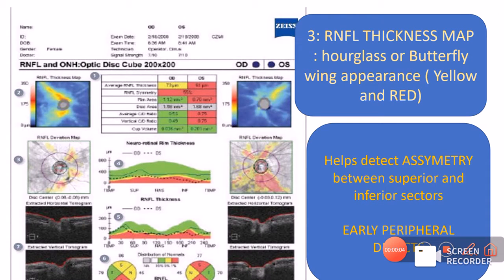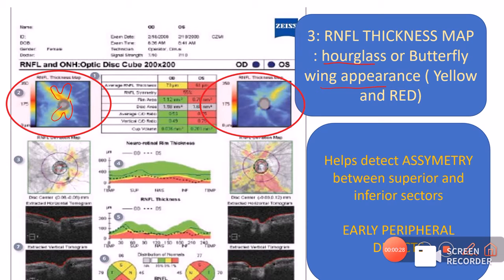The next component is the RNFL thickness map — a tomographic map taken over the RNFL cube, showing the thickness around that cube. Normally, the thickness appears in an hourglass or butterfly wing shape, usually red or yellow in color indicating normal thickness. This map helps detect asymmetry between the superior and inferior quadrants and can detect early peripheral defects, which will appear blue or greenish — sometimes even black. Such blue notches in between the normal reddish or yellow butterfly shape indicate early peripheral defects.